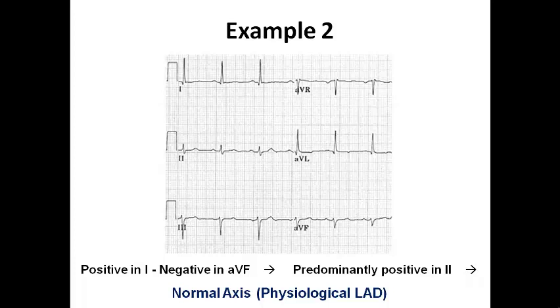No, we have 2 simple quadrants of the right axis deviation and the extreme axis deviation, and we have another sector which has about 120 degrees and the smaller sector for the left axis which has only 60 degrees.